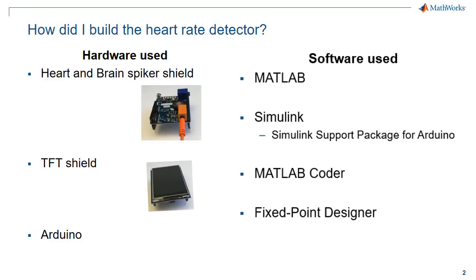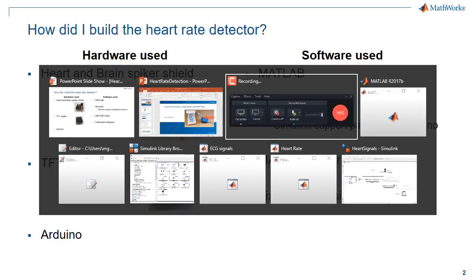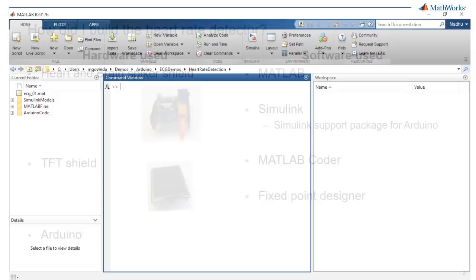On the software side, I'm using MATLAB, Simulink, and the Simulink support package for Arduino, MATLAB Coder, and Fixed Point Designer. Let me go to MATLAB and show how all of this works.